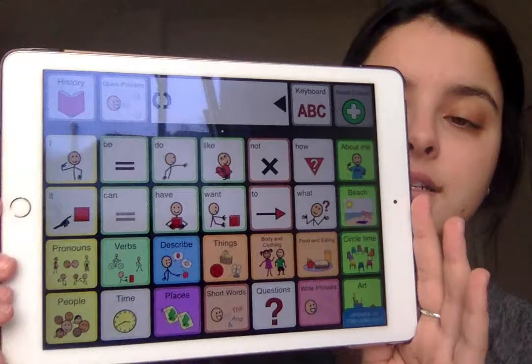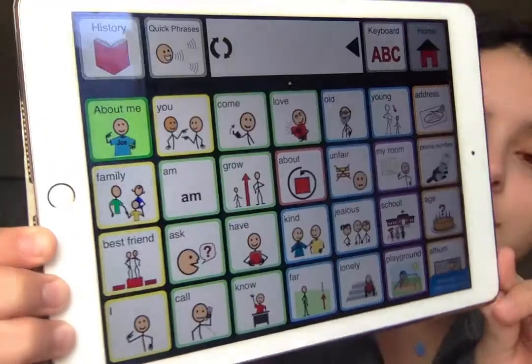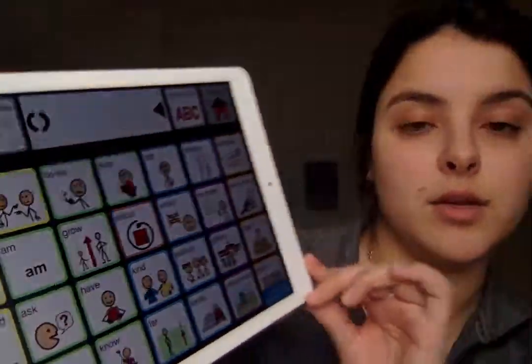Kids get really skilled with this, and it's awesome because they do have to be trained in where the icons are, and that can be done in an ABA therapy session or speech therapy. They work on this a lot, and you can customize it, like an about me, and you can program different things in there when you have the actual version.